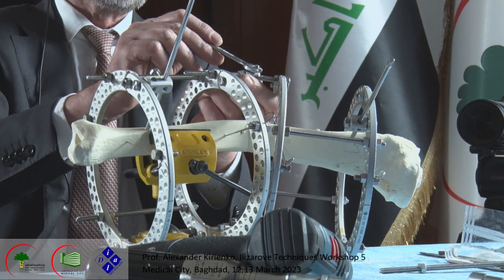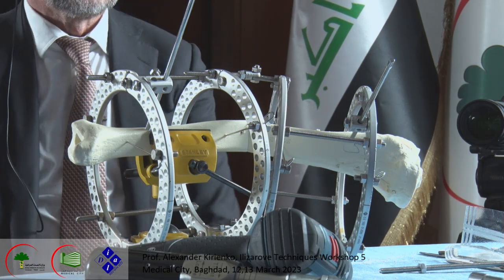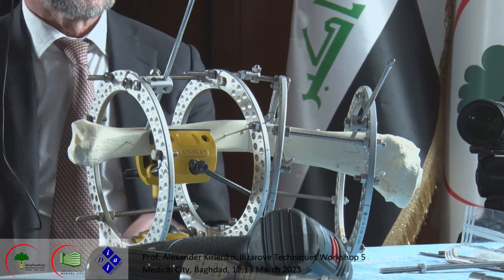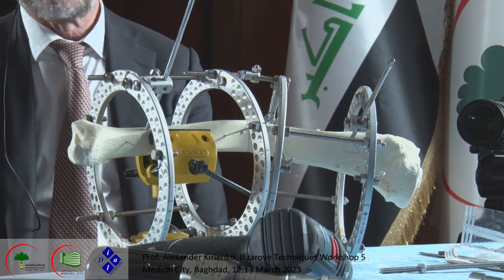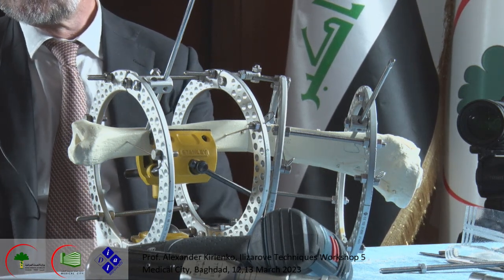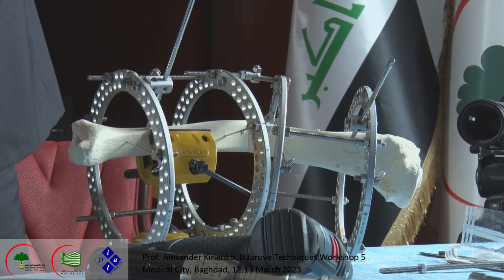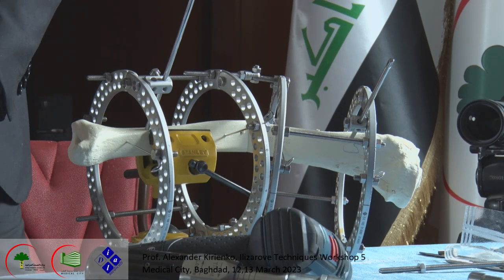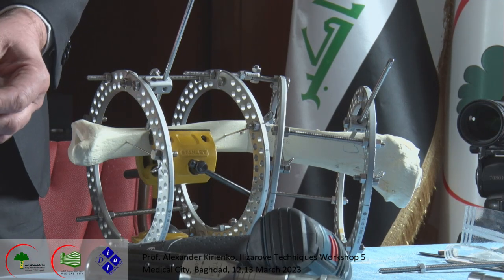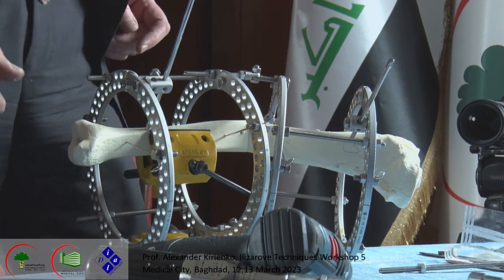We find this. This is a hinge for correction. And what we should do, we should create the motor for this correction, because this is the more important thing to do. Well, how do we do this? Probably we have some kind of motor. We may do this, or if you want, we may use this one, for example.